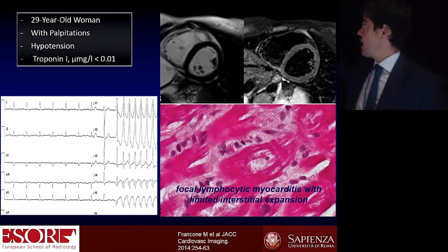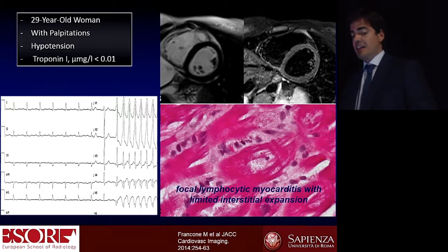Another example: arrhythmic presentation, hypotension, palpitations, and again, late enhancement and edema completely negative, unfortunately matched with a histological diagnosis of myocarditis.